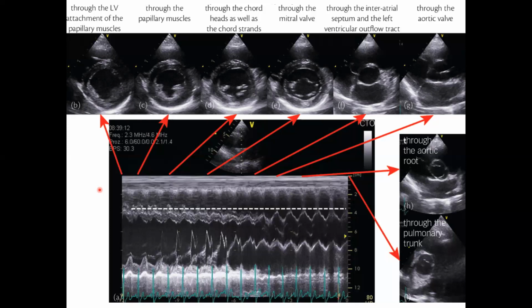And you didn't have to do any spatial encoding because you isolated your signal to that blood in the aorta, and then you got a phase map along that line, and it was very, very fast, right? And so you can measure stuff like the acceleration of the blood and whatnot. We thought we could predict when a person was more likely to have a rupture in their aorta, right? Because what happens sometimes is people's aortas start to expand, they dilate, and you see it on their CT. It's easy to see, obviously, and on their MR, but the question is, when's that thing gonna rupture?